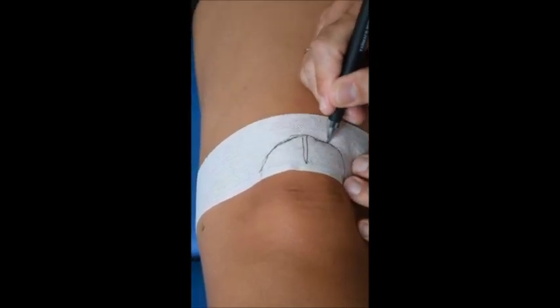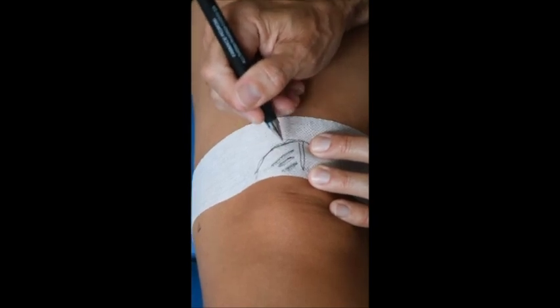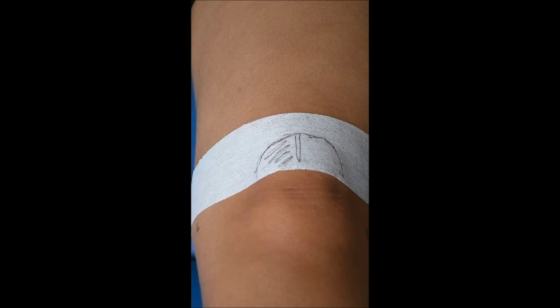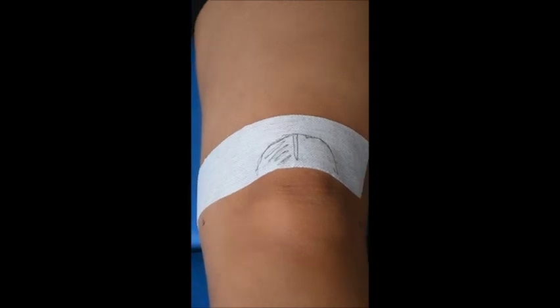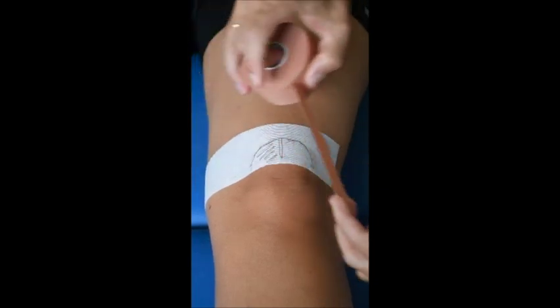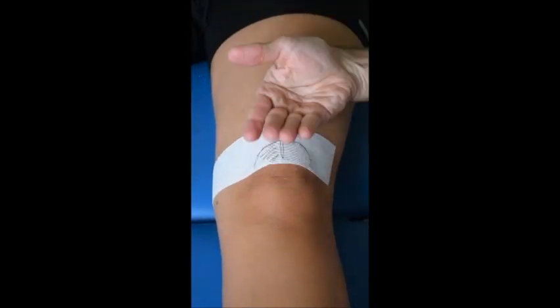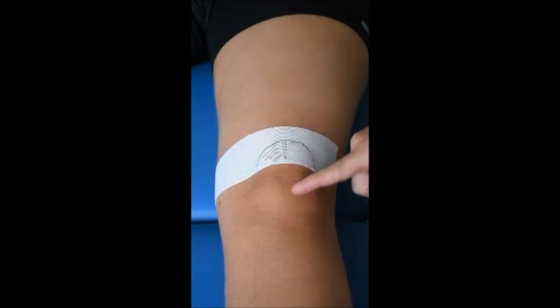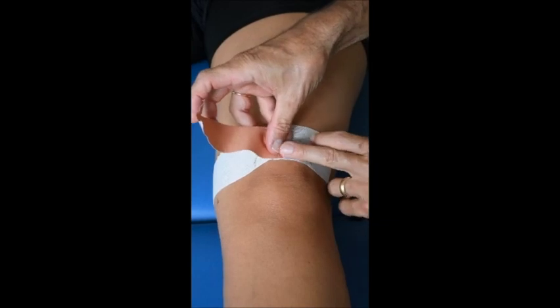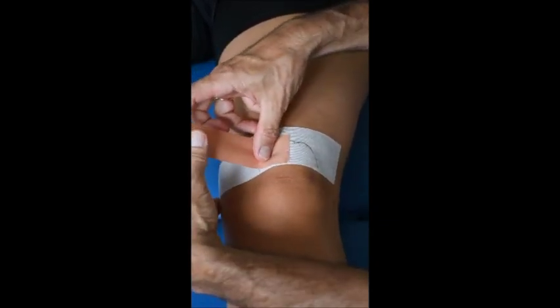What we will do, we will place our tape in what we call the upper medial quarter of the patella. We will use again our rigid ENDURA tape, and this time, in order to lift up the apex patellae, we will stick the tape over the superior medial quarter of the patella.